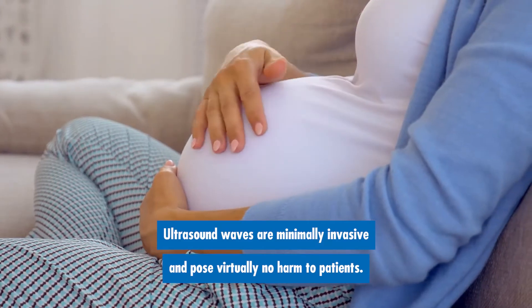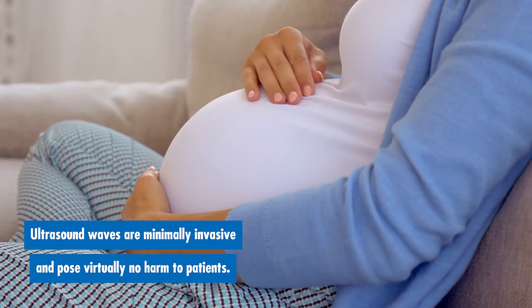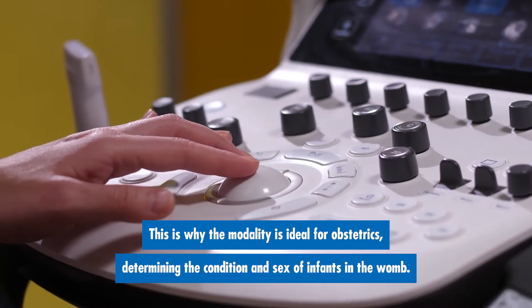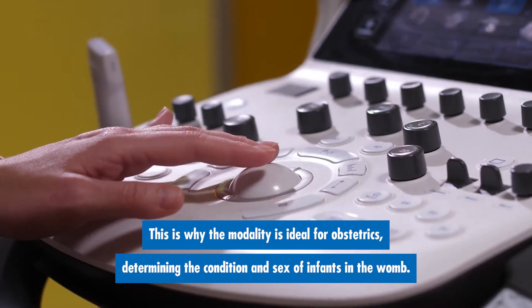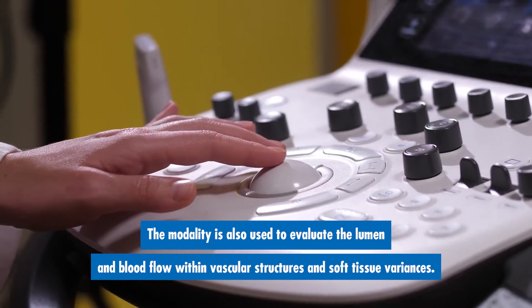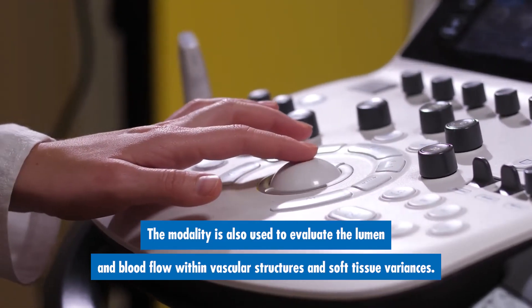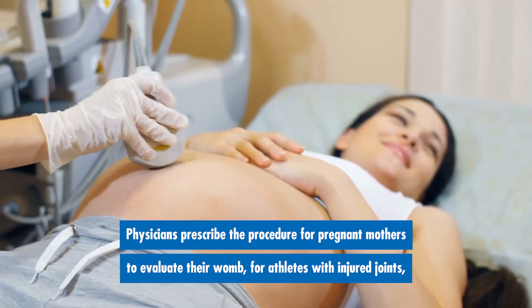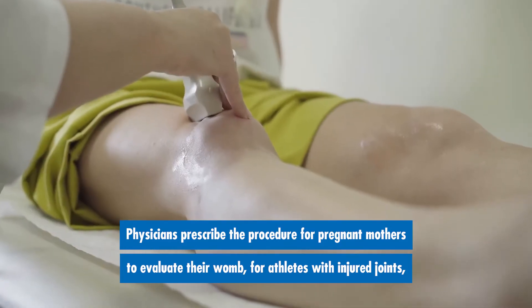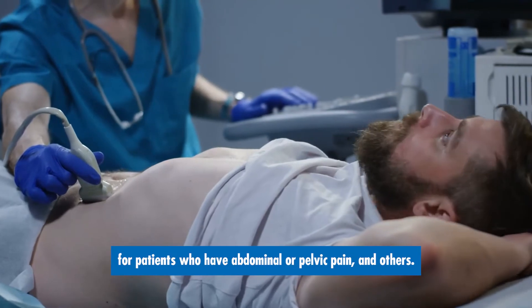Ultrasound waves are minimally invasive and pose virtually no harm to patients. This is why the modality is ideal for obstetrics, determining the condition and sex of infants in the womb. The modality is also used to evaluate the lumen and blood flow within vascular structures and soft tissue variances. Physicians prescribe the procedure for pregnant mothers to evaluate their womb, for athletes with injured joints, and for patients who have abdominal or pelvic pain.